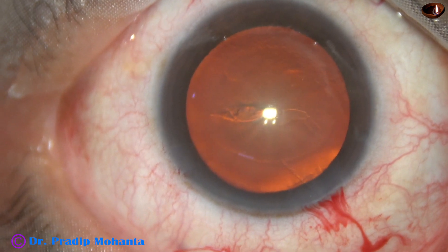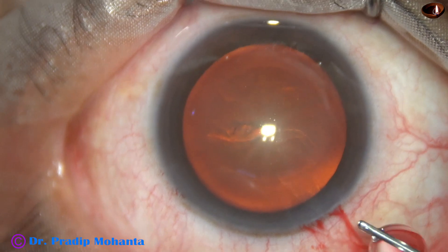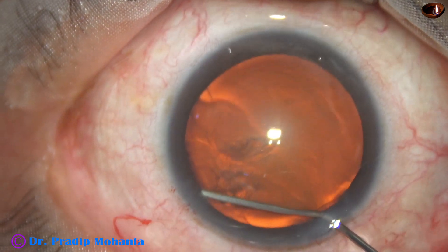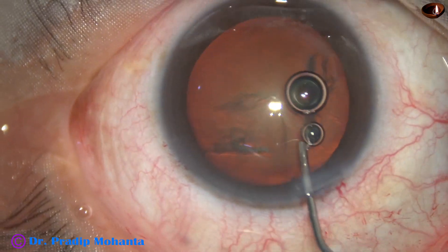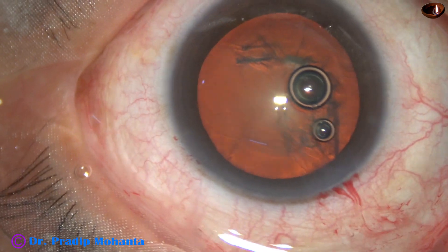Hydrodissection is done with BSS and a 27-gauge cannula. You can see that the fluid wave goes from one side to the other side. The nucleus is ballotted and the nucleus rotates nicely.